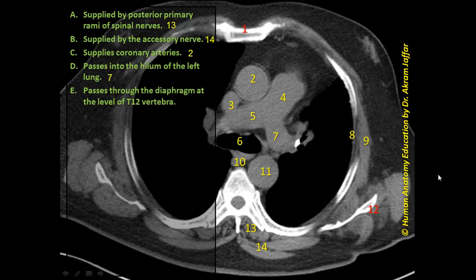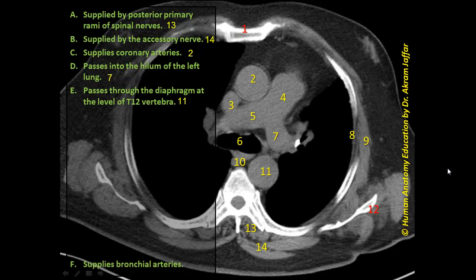The phrase 'passes through the diaphragm at the level of T12 vertebra' — the structure that passes through the diaphragm at T12 is the descending thoracic aorta, to become the abdominal aorta. So this matches with structure 11.